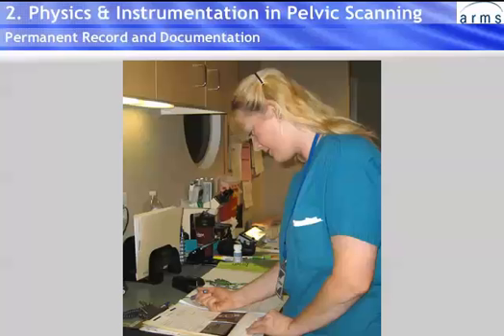Documentation in the record should include name of the patient, medical record number, date of scan, name of health center where the scan was performed, name of operator, findings, i.e. number of gestational weeks, cardiac activity seen, etc. Gestational age by ultrasound is commonly indicated by menstrual weeks, for instance, 6 weeks, 3 days, or 6 3/7.